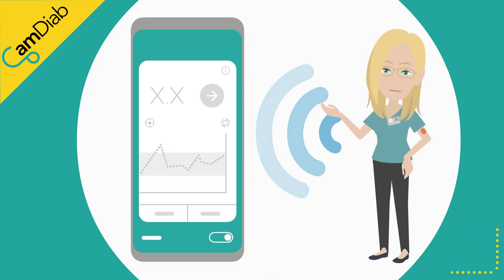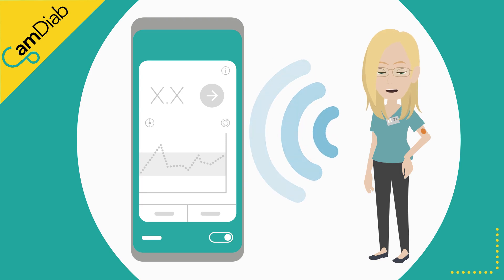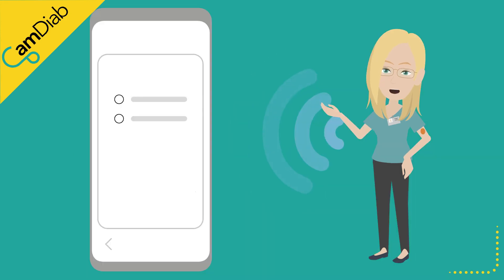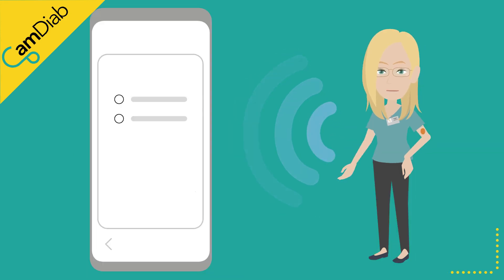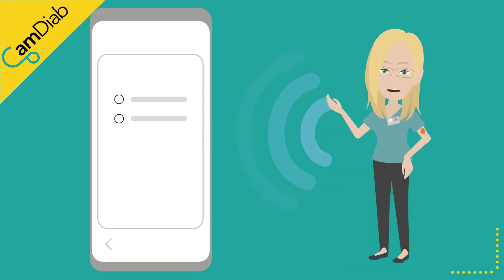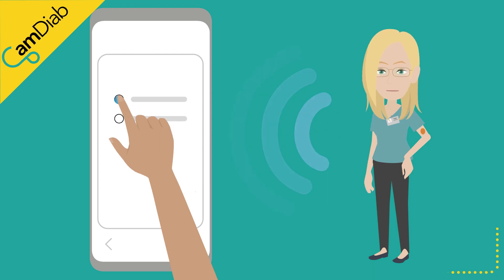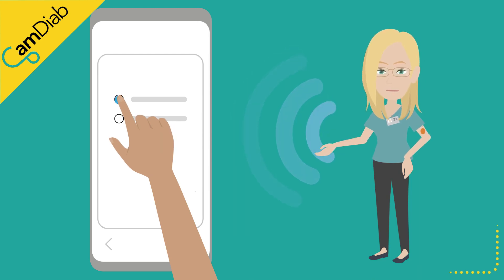Once your pump has been successfully paired, you then need to connect your glucose sensor to the CAM APS FX app. You are able to transfer a working Dexcom G6 sensor from the Dexcom app to the CAM APS FX app. Tap on Dexcom G6 to start the pairing process and follow the app's instructions.